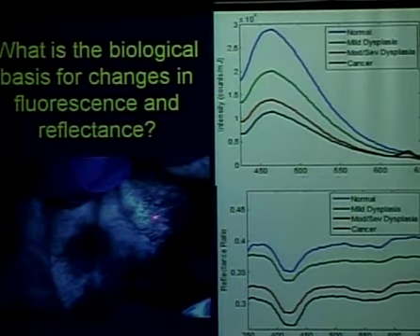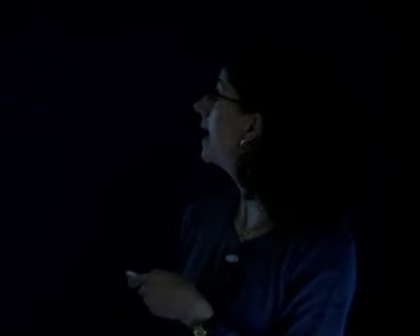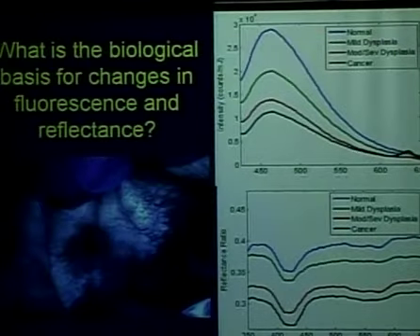So these are just repeating some of the slides that Anne showed where we see this loss of fluorescence associated with lesions and wide field images. And here when we look at the spectroscopy data, this is at 350 nanometer excitation. As we go from normal to mild dysplasia to moderate dysplasia in cancer, again, we see that drop in the fluorescence, and we see a little bit of a shift to longer emission wavelengths. And these data presented here were collected with the shallow channel of that ball lens tipped probe.